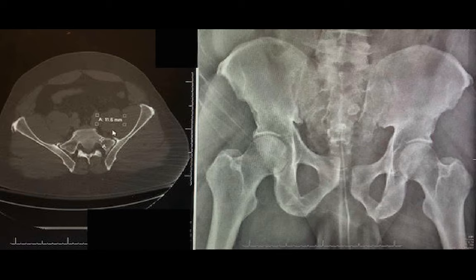So I measured it here at its narrowest point. I cannot really scroll through the whole CT and show you, but suffice it to say that here the narrowest point through S1 is 11.6 millimeters. And when you consider that your SI screw is around 7.3 millimeters, you can put a 6.5, but I try to keep my screws to either 7.3 or larger for fixation. You don't have a lot of wiggle room there, and there are obviously dangerous things here, and the L5 nerve root is right there. So if you breach that, you can cause basically a foot drop and an L5 palsy.